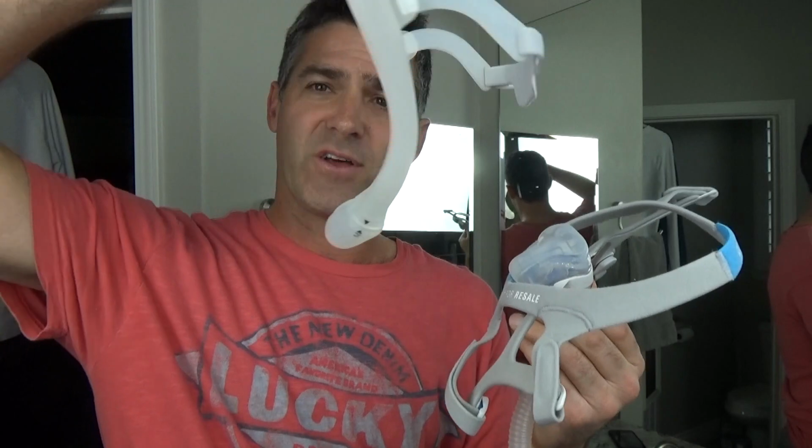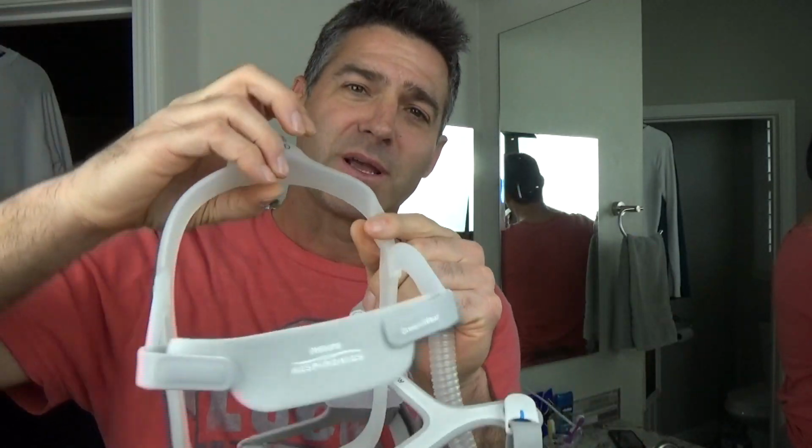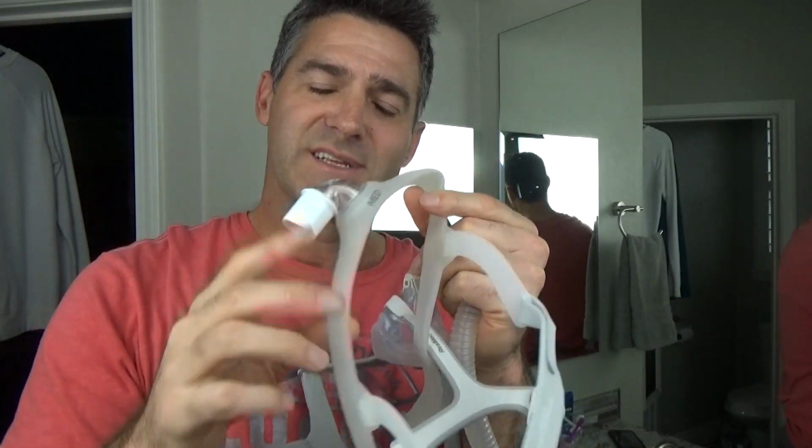Now I'm gonna show you one method as far as cleaning. This is just the N20, the ResMed N20 mask. Then I have the Philips Respironics mask. Now this is different because this has that tubing where the air travels down. So, oh my God, how do you get in there? I don't know. I get that question a lot. I'll show you exactly how you do it. I also have some tubing. It is the climate line tubing, so oh my God, how do we clean that? And I also have a humidifier. All right, let's get started.